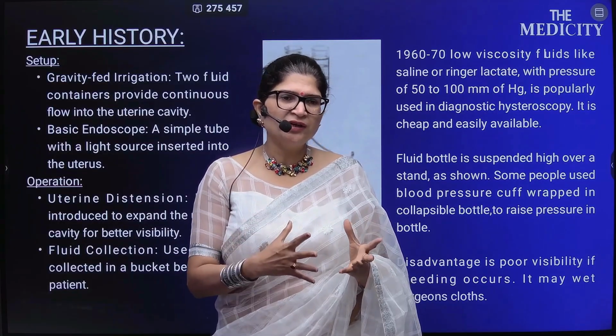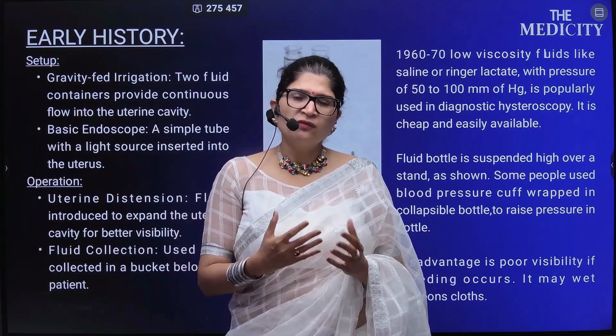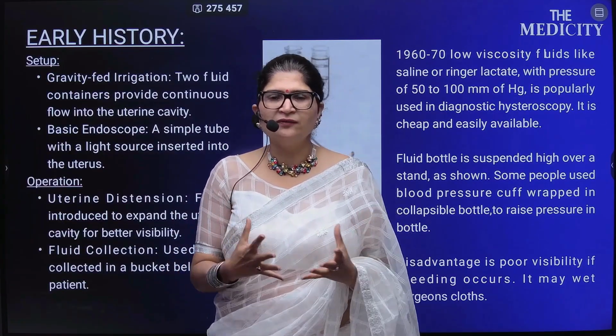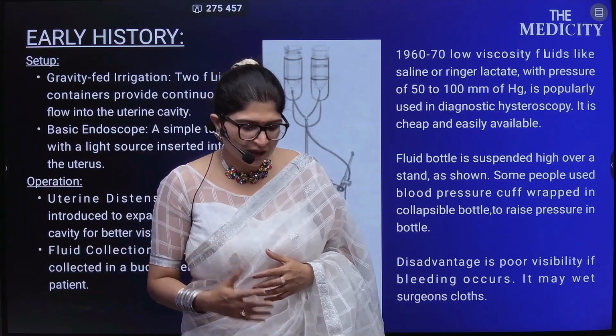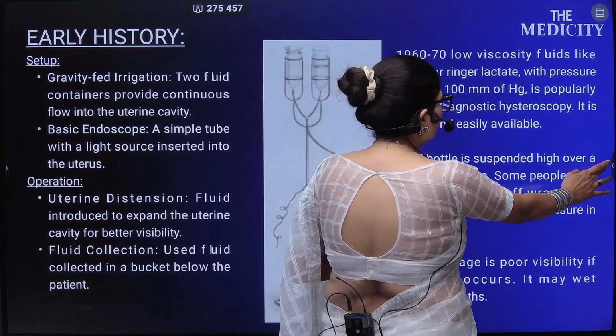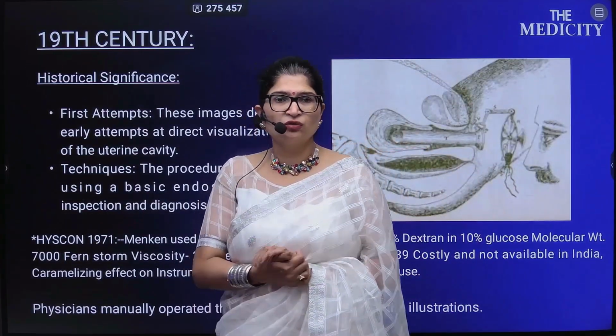And with the latest equipment, we are now dealing with some of the best instruments, where the disadvantages are overcome and better instruments have come onto the market, which we are using these days for operative hysteroscopy and different surgeries with the help of the hysteroscope.